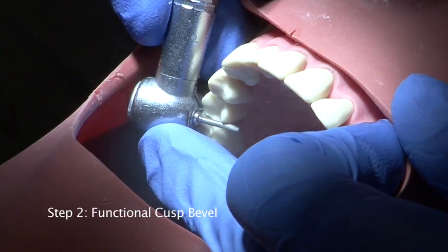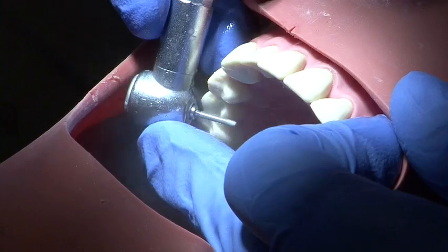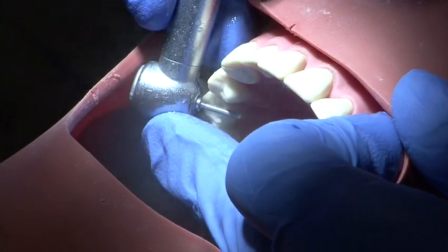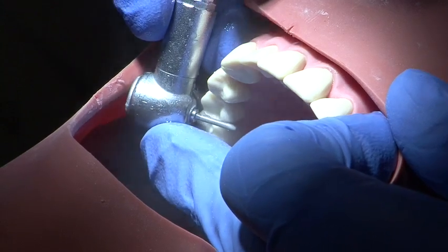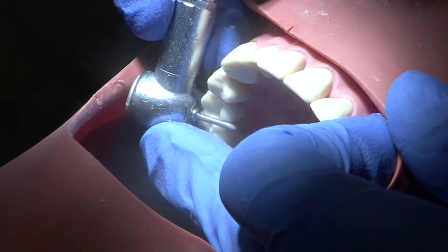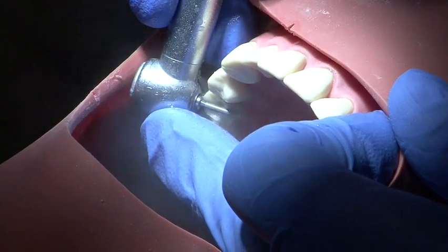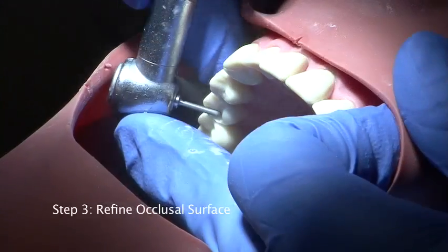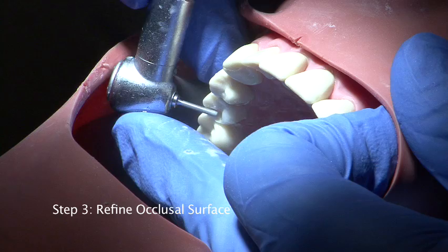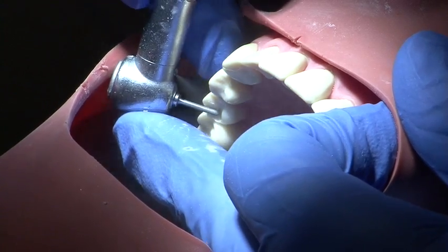The functional cusp bevel is carried out to a depth of 2mm on the palatal cusp for the upper tooth. Following occlusal reduction, the surface is refined using a fine grit burr.